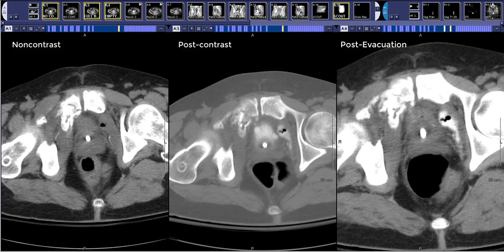Of note, if you're ever protocoling a study, occasionally teams will ask you to clamp a patient's Foley catheter and to do a CT cystogram, and I'll just have you know that that's an inadequate way to do a CT cystogram. You really have to instill via gravity drip and achieve a pressure head. You're at risk of causing a false negative study by just clamping a patient's Foley catheter, especially if their renal function is tenuous, because the kidneys, native kidneys, even if they're working well, cannot fill up the bladder soon enough to get an adequate CT cystogram image.